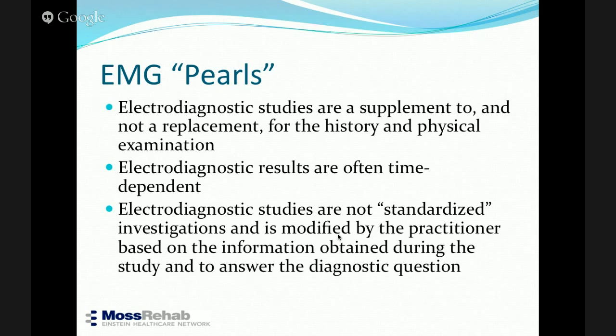A more experienced person will probably do a better job. A less experienced person is not going to think through all the processes. If it's a technician doing it, they're doing just routine tests, and that means you're not going to get all the information you need. I've seen people who have absolutely no idea about EMGs doing the studies. I saw a study the other day where they took 60 cycles, which is normal ambient noise, and put in onset latency, peak latency, and duration, and said this is a normal conduction study. There was not even a response. So you have to be very careful. People do all kinds of shams. They don't even know what they're doing. So you have to be careful.